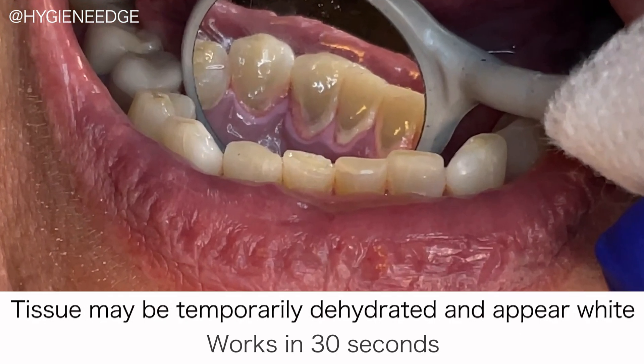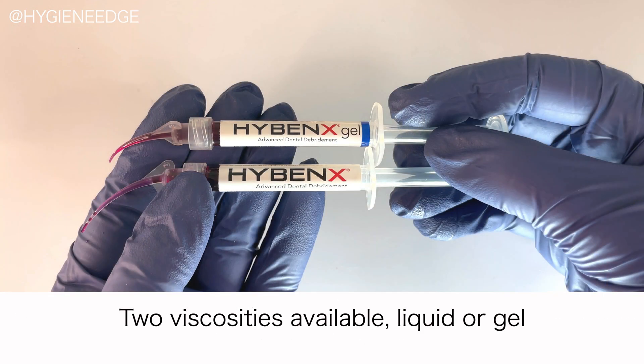It takes place in less than 30 seconds. For your handling preference, there are two viscosities available: a liquid or a gel.